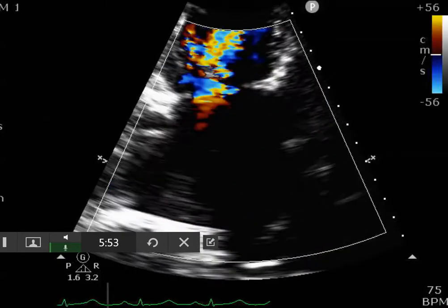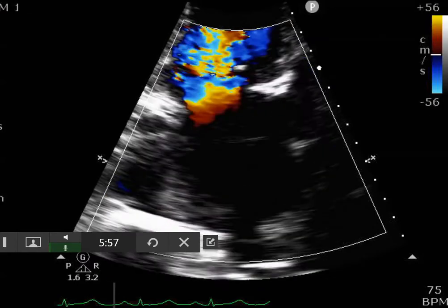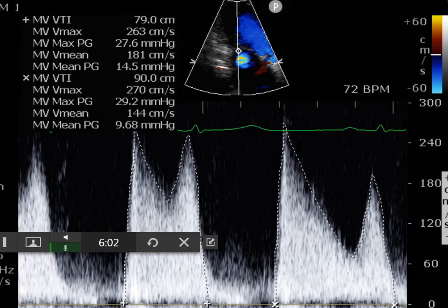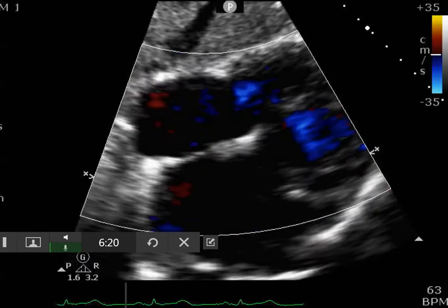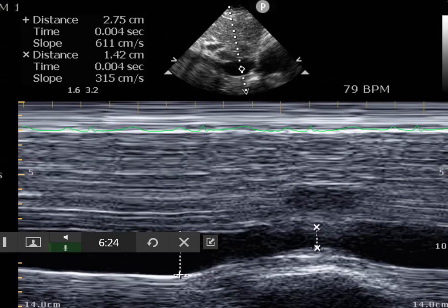The mitral valve seen here on 2-chamber. A lot of turbulence again. The aortic valve looks fine, and so too are the gradients. Again, I would probably measure it a little bit here, cutting out the hairs in here. Okay. And finally, looking at the subcostal view. Fair amount of TR. Actually, maybe not so much, mild or moderate. The IVC looks large but collapsed.